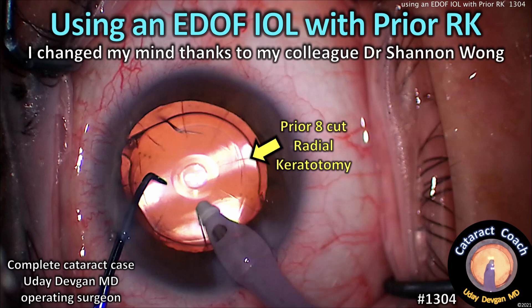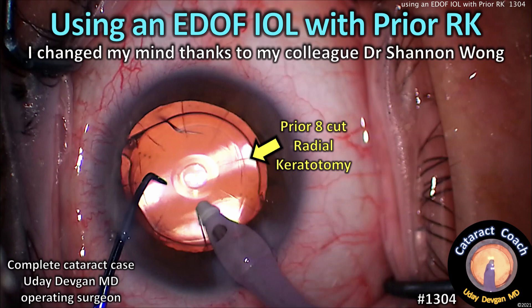CataractCoach.com. Using an EDOF IOL with prior RK.